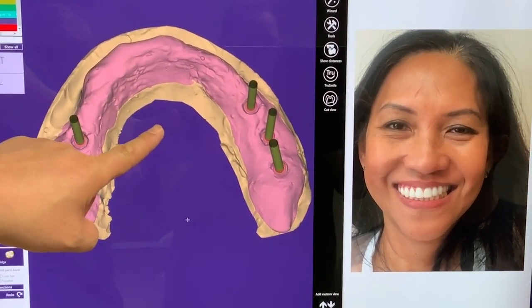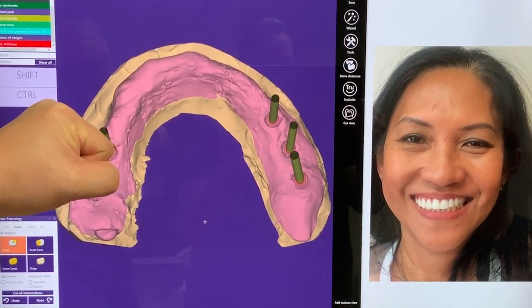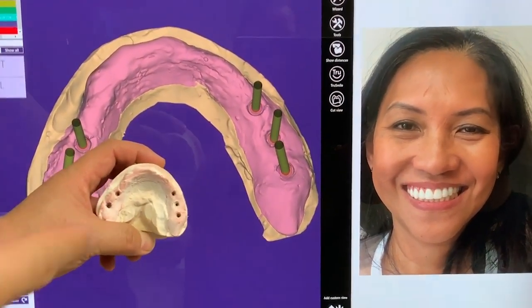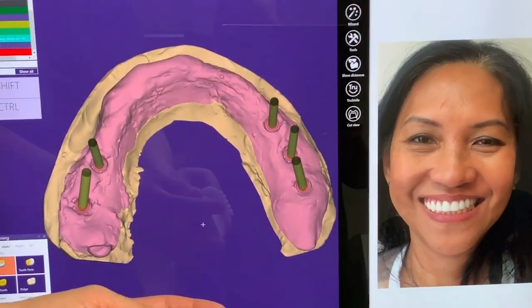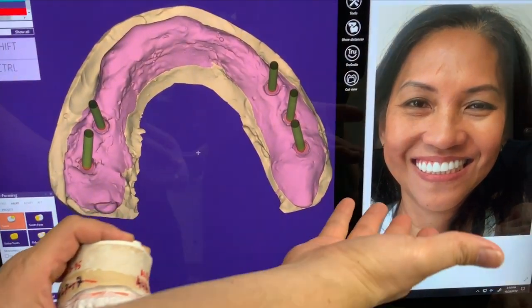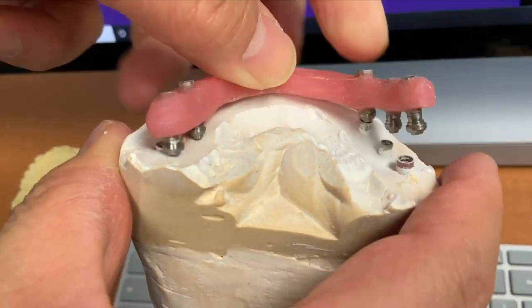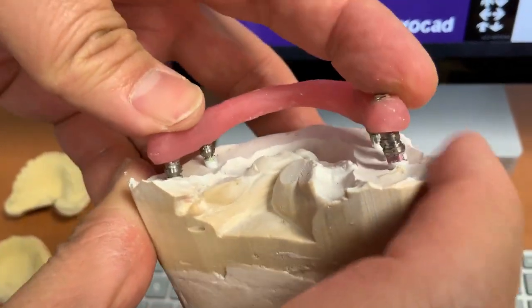What we're going to do is explain that we don't need any more additional implant sites. We took a great impression and have a model of five implants. There's a little bit of excess hole but that's not bad. On top of that we made the wax try-in, sprayed it to put in the scanner, and tried it in the patient's mouth after checking the verification jig. Everything fits perfectly.